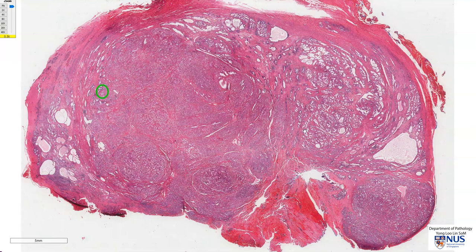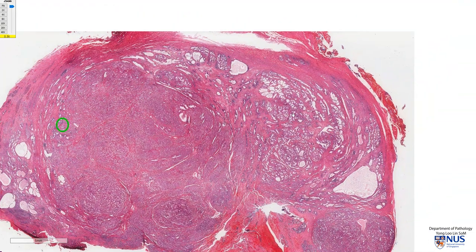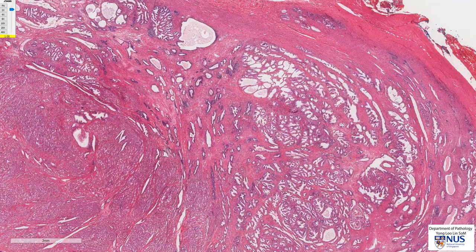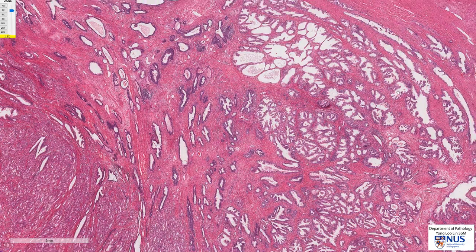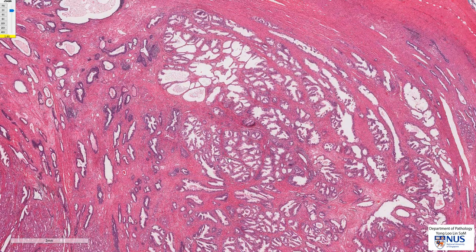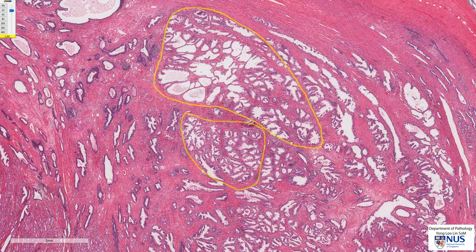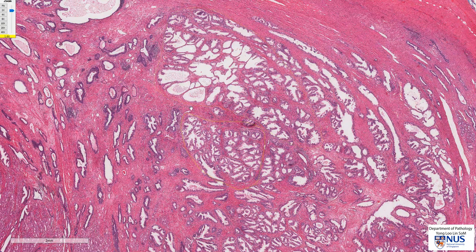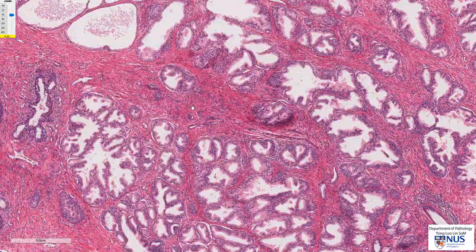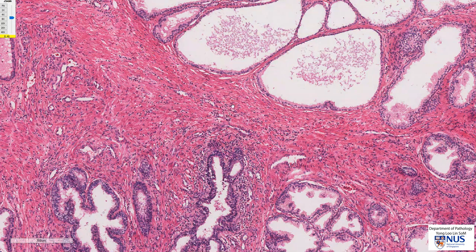Let's first have a quick recap of normal prostate histology. We can see here that normally the prostate is composed of these lobules of glands, and the lobules are relatively well delineated. In between the lobules of glands, we have some smooth muscle bundles and some fibrous tissue, so we have a fibromuscular stroma.